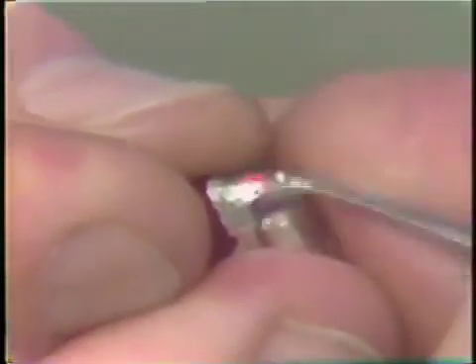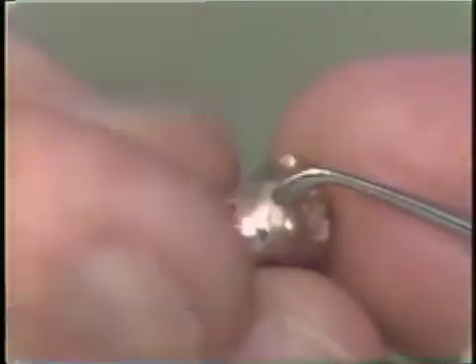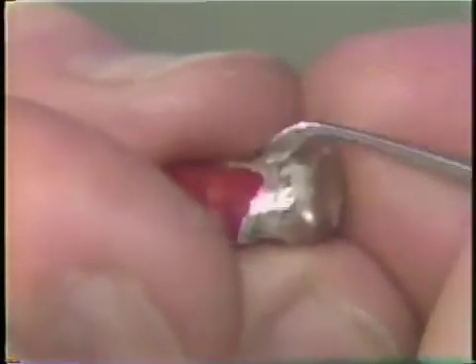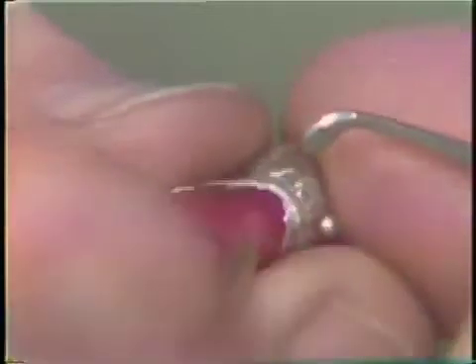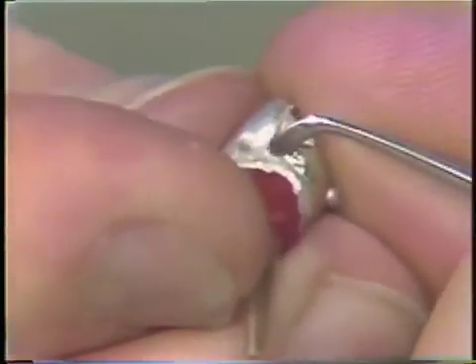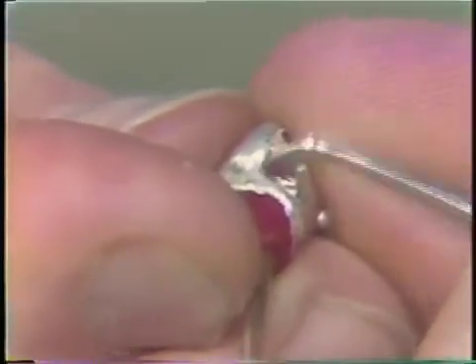A 5S burnisher is used to burnish the margins. You'll notice that we are burnishing parallel to the margins and with a slight amount of pressure. This is only possible on a metal die, for if we would use a stone die, this would destroy the die.